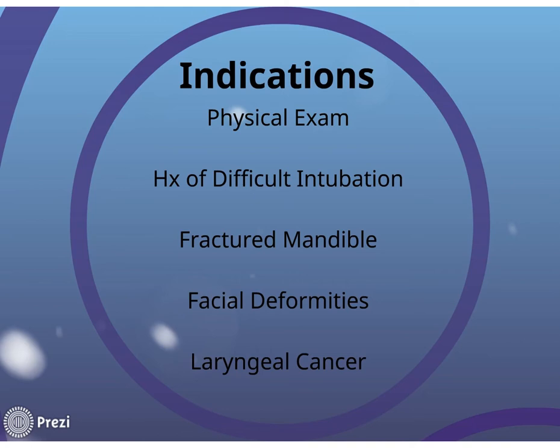Because even if it's not traumatic technically, like you've not caused any technical damage, it's traumatic, just like when you put an NG tube in an awake patient. I mean, it's more trauma for you. No, it's not really, it's more trauma for the patient, but you know how uncomfortable it makes you feel? You're trying to talk them through it like it's no big deal, but you know it's a big deal. So if you can just give them a little bit, I think that helps. Realize, though, it's not always indicated. You might have someone that really can't do it.